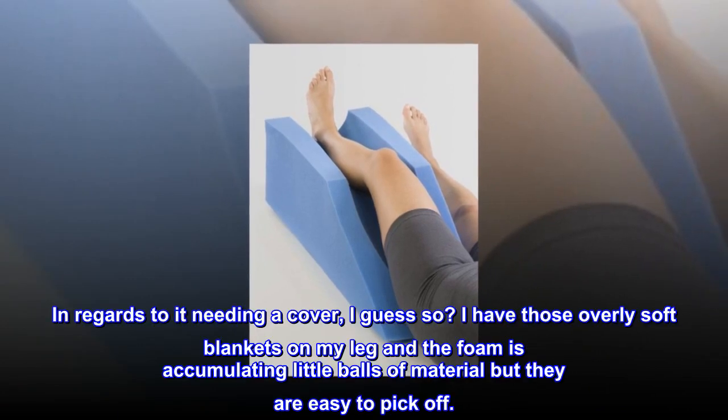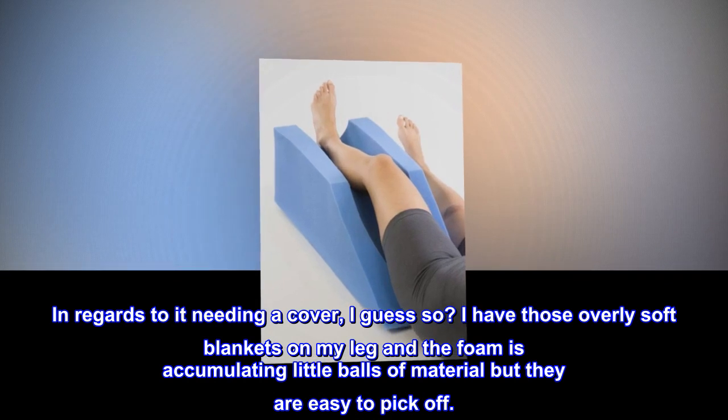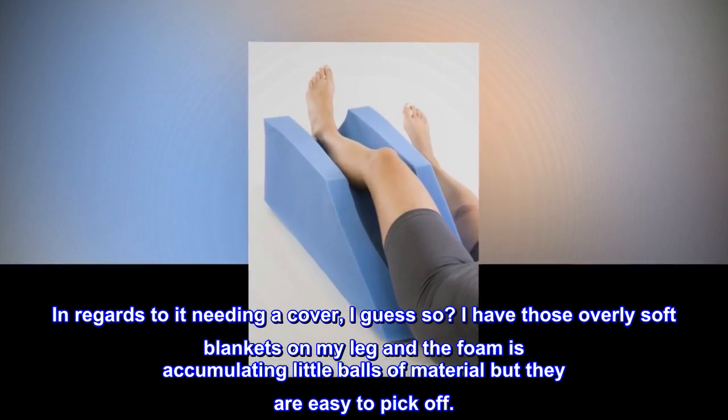In regards to it needing a cover — I guess so? I have those overly soft blankets on my leg and the foam is accumulating little balls of material, but they are easy to pick off.